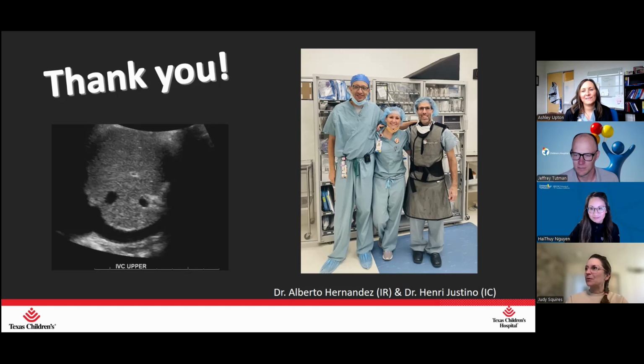We still report our values in velocity, so meters per second rather than kPa, because of the original SRU paper. And they were very confused by that also. I think there's too much overlap between the fibrosis stages to put that in a report and have the parents freak out, the patient freak out, depending on the age of the patient, and then the clinicians. Maybe one day we will be there.